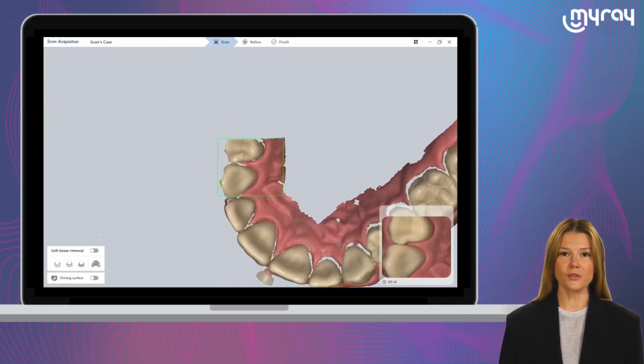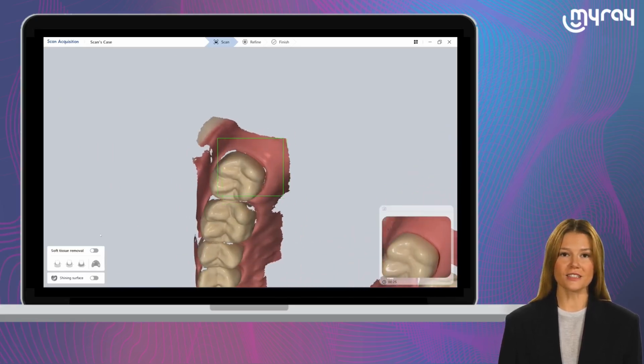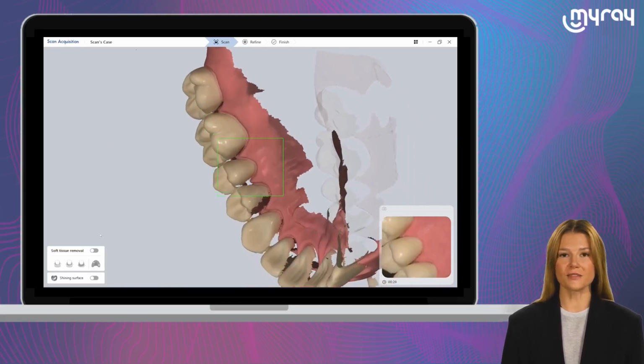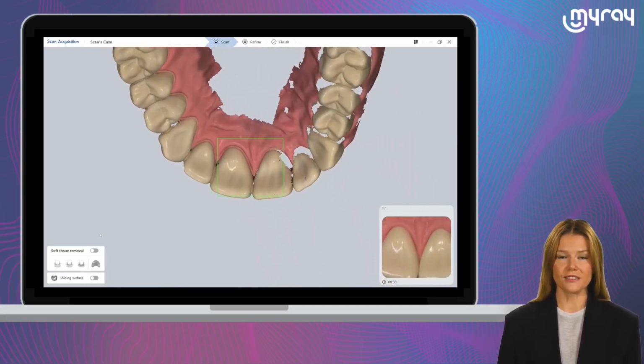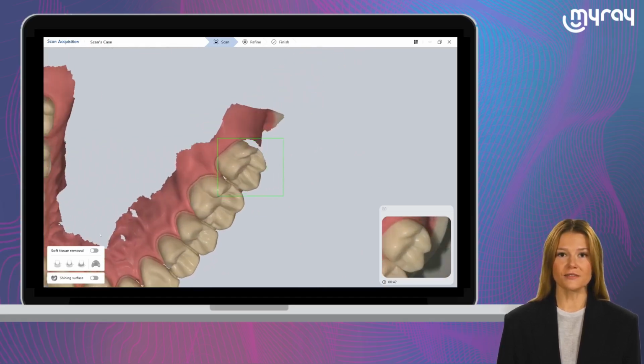We activate the recording with the start button and carry out the acquisition of the entire occlusal area, carrying out zigzag movements, which will allow the acquisition of the occlusal part and the vestibulolingual references. This will help to have an accurate and defect-free model.